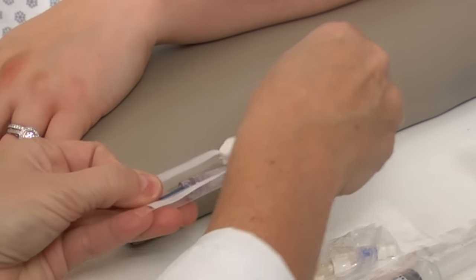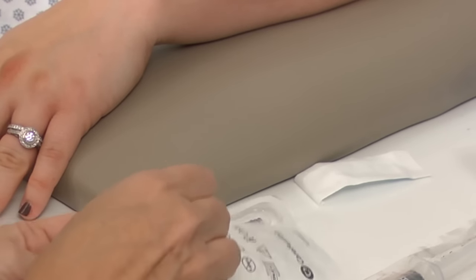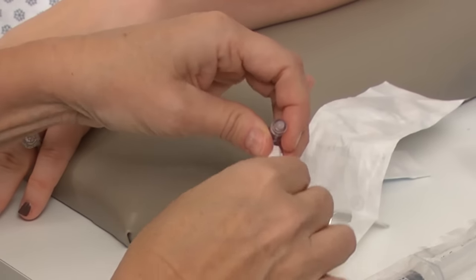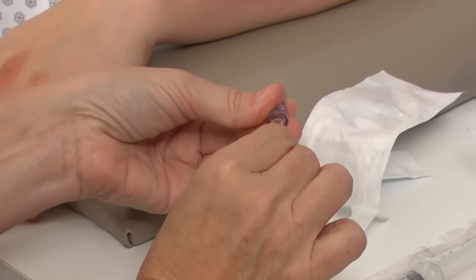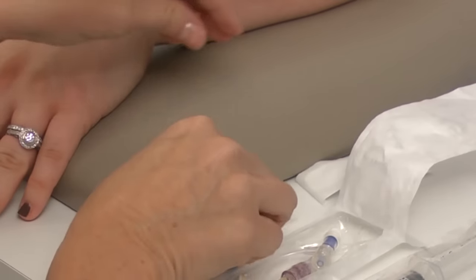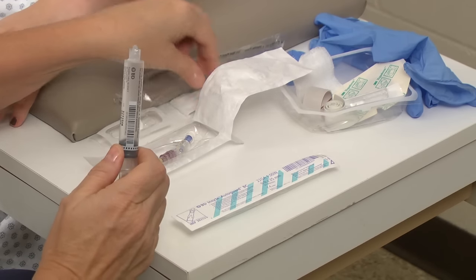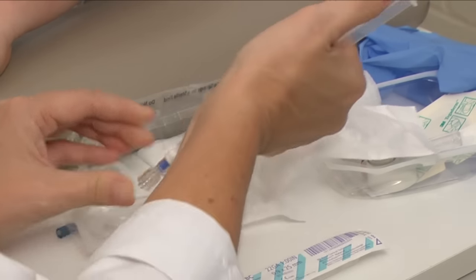Open all of the materials, maintaining aseptic technique. Having a garbage can close by will help decrease clutter. You will then need to connect your pieces — remember to avoid touching the ends. Next, flush the saline lock and extension tubing. This will ensure the tube is patent and prevent air bolus to the patient. You will need to flush all ports on your tubing.